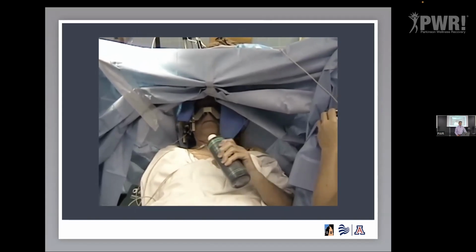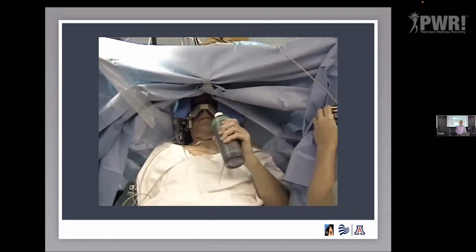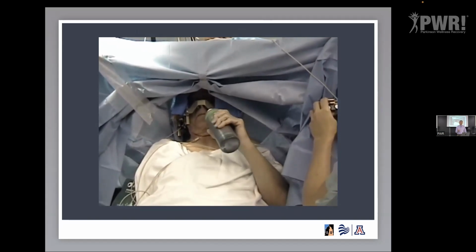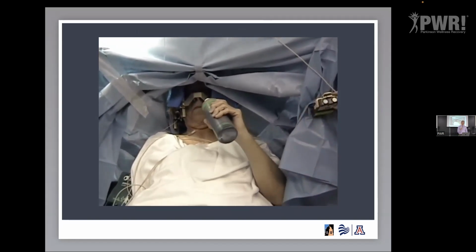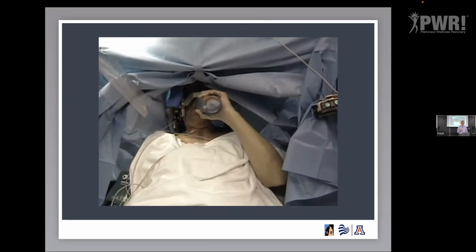Hopefully I'm not standing in front of the screen for everybody, but we're going to turn this electrode on. And as we turn the amplitude of stimulation up, you're going to see this tremor gets better as we turn it up. So in the old days, this was a way of confirming that we were in a good spot. It's good for us. It's not so easy if you're a patient undergoing a brain operation while you're awake. It's a little bit intimidating.